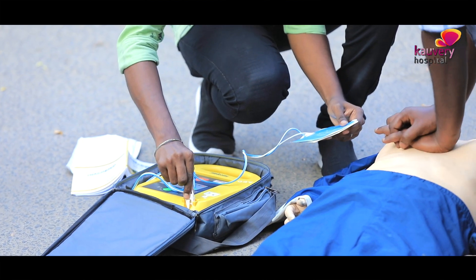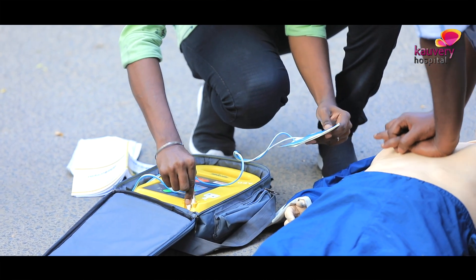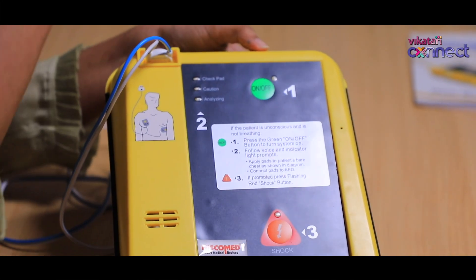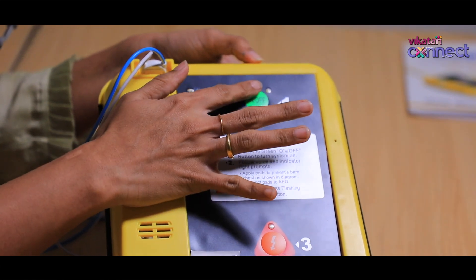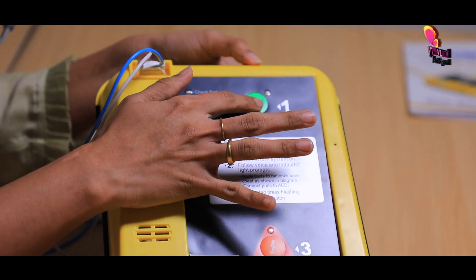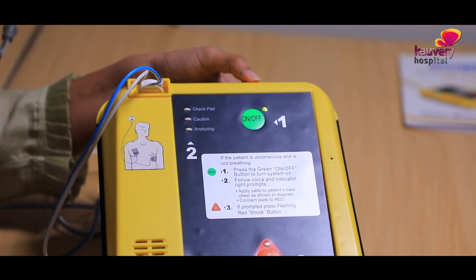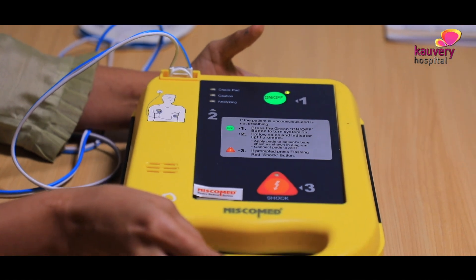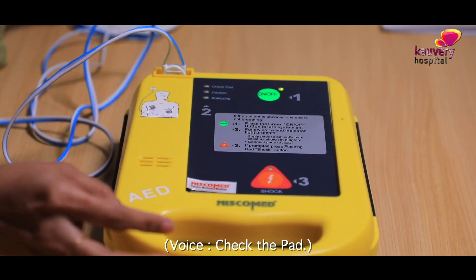To use the machine, fix the pad connector into the socket. Then there is an on-off button. In most AED machines, there is a lid or an on-off button. If you press the on-off button, the machine will tell you what to do next. Once you do that, it will give you a series of prompts.